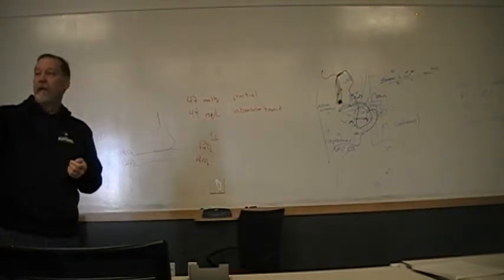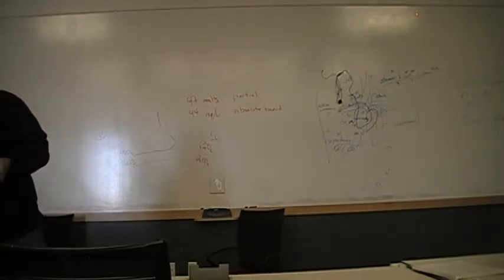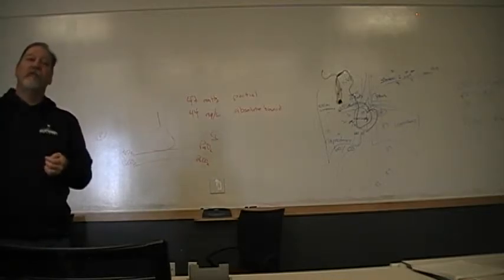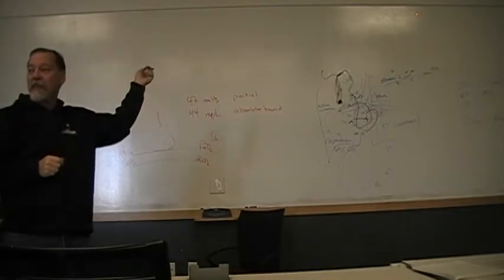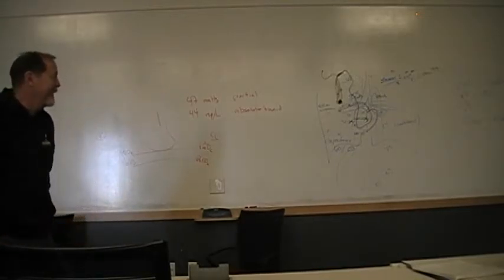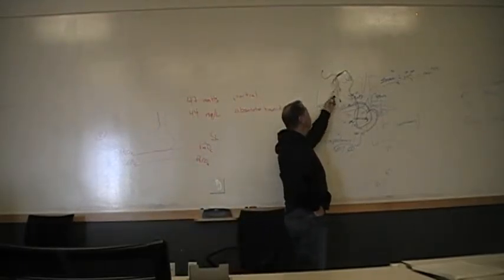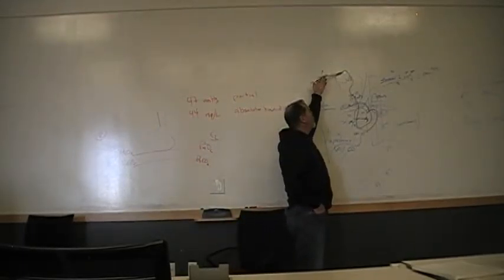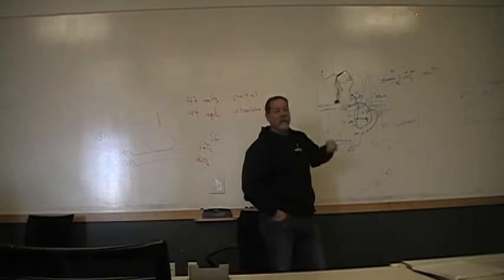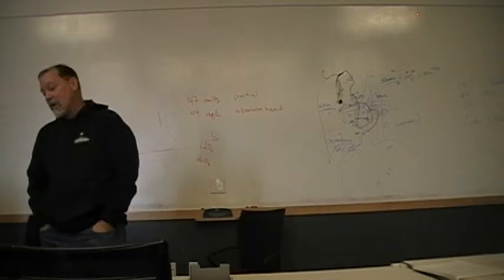So if I take it off and put it in the sheets on the bed, and then it rolls around and I pick it back up off of the sheet and stick it back into the central catheter. Where's that infection going? Right to that patient's heart. So this is an invasive catheter that's ripe to introduce infection into the patient's central circulation. We have to be aware and knowledgeable about that.